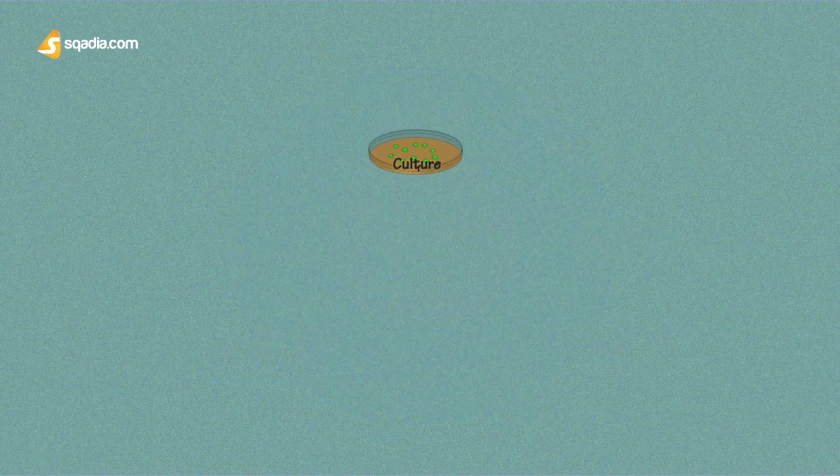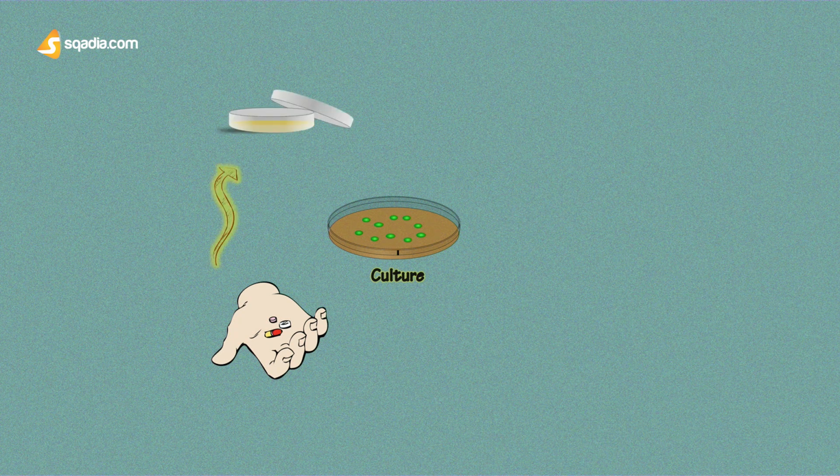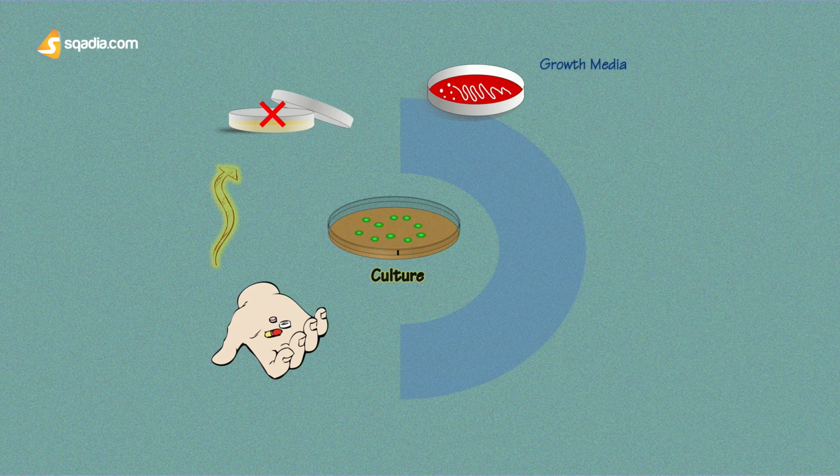Let's discuss how we culture organisms. First of all, antibiotic therapy administered pre-sampling can falsely render samples culture negative. Most human pathogens are fastidious, which means requiring media supplemented with nutrients to support their growth and increase their number to detectable levels. Growth on solid media allows the organisms to be separated into individual colonies. A pure clonal population permits subsequent identification and susceptibility testing.